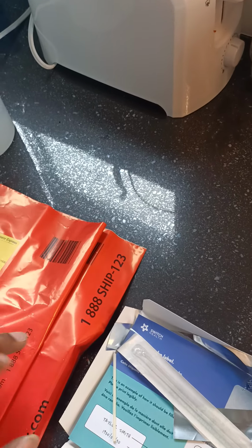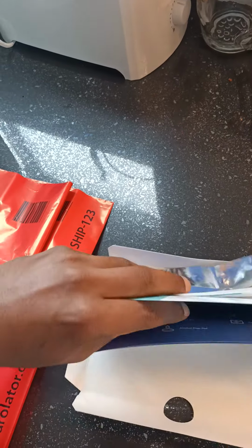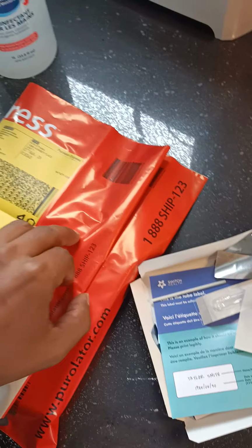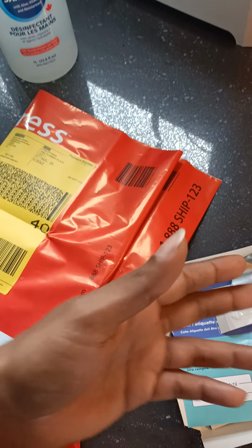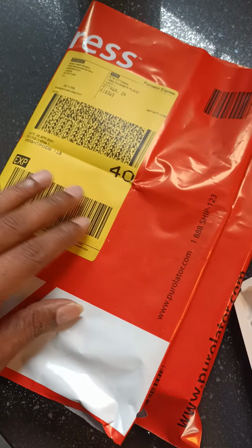Then they will ask us to clear off the box. Once we clear off the box, this biohazard bag goes inside that box, and then we have to seal it off with a sealing tape. That tape is also provided inside the kit. It was actually here in this. I already peeled it off and used it. Then you stick it on the box and seal it. Then there is a packet inside the box itself, which we already removed from the box. With that package, we open it, put it inside and seal it off, and that's it. Then you have to note down the tracking number.